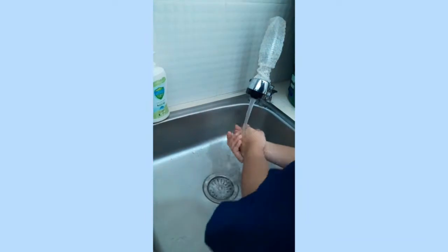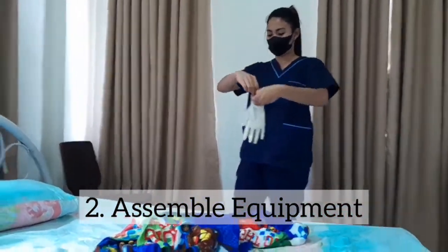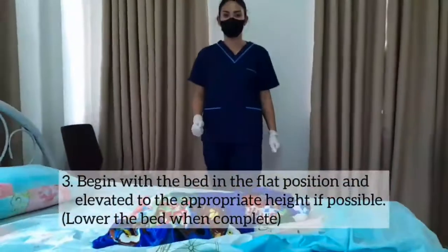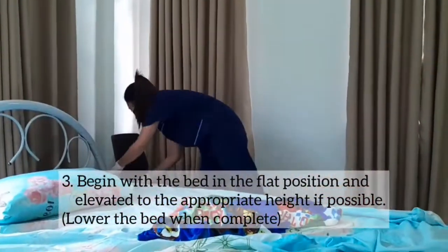Step 2: Assemble the appropriate equipment and place it in the appropriate place. Step 3: Begin with the bed in a flat position and elevate it to the appropriate height if possible.